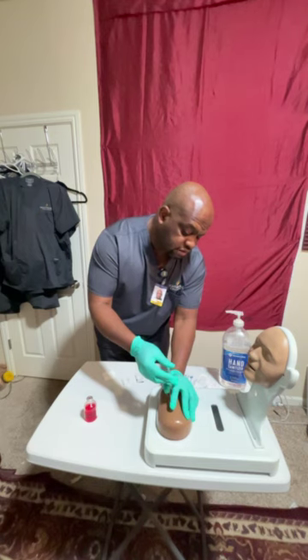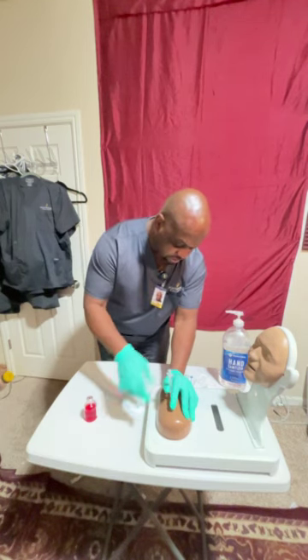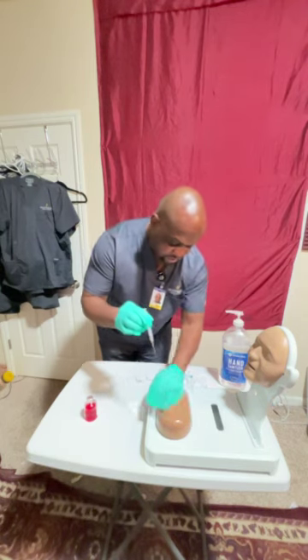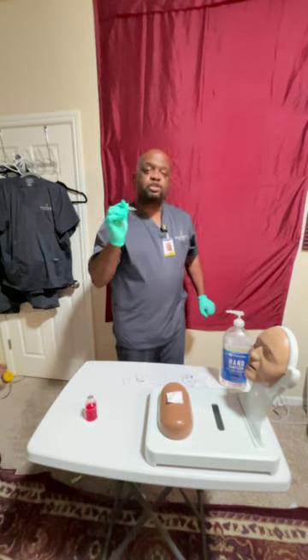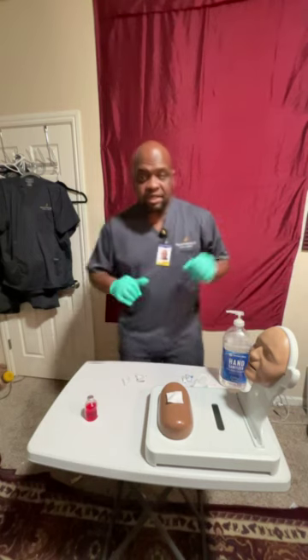Okay, 10 seconds per mL, putting that in slowly. Good. All right. And getting my alcohol ready. And I'm going to remove the syringe and put the alcohol right above it. Not going to massage it. This goes right into the sharps container. Syringe is in the sharps container. That's in there. That's good.